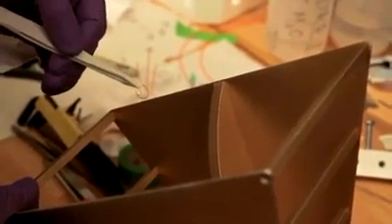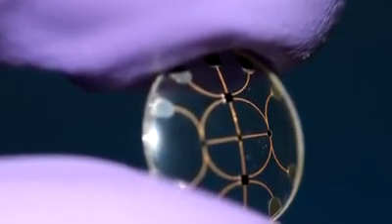The second area of interest to our group is trying to build contact lenses that incorporate the display. So you could wear these lenses as you would wear normal lenses pretty comfortably throughout the day, with the added benefit that they can show you information. Building a heads-up display in a contact lens could fundamentally change the way humans perceive and interact with their world. Dr. Parviz and his team are still in the very early stages, but they've made the first steps.